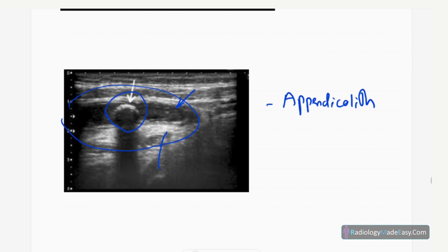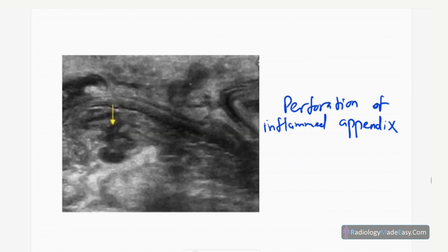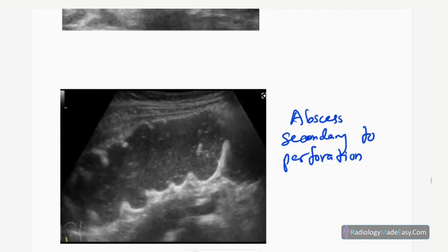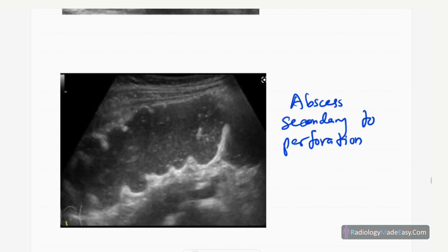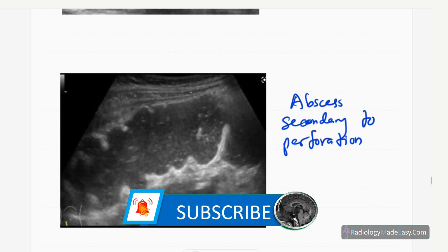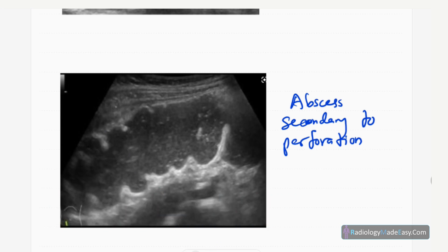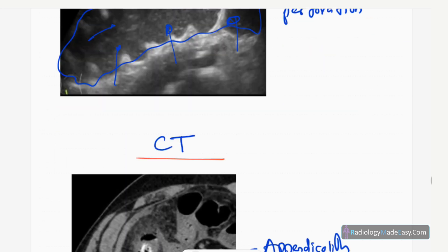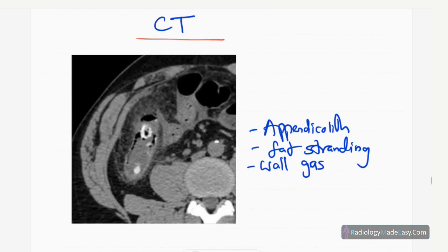Here is a complicated case of appendicitis. You can see the appendix with local perforation in the wall and fluid in the region of the tip of the appendix, indicating localized perforation. Surrounding fat edema is also visible. In another image showing perforation progressing to abscess formation, you can see an anechoic area in the RIF region representing abscess fluid.